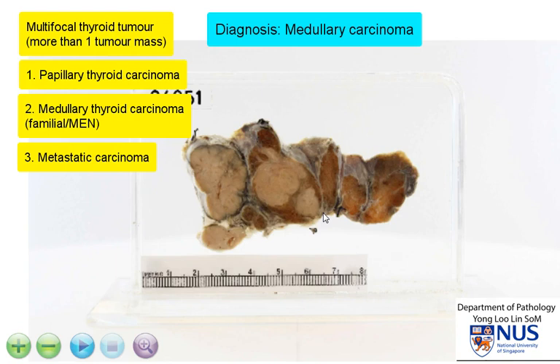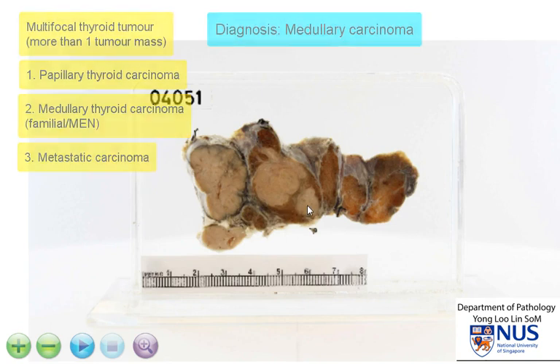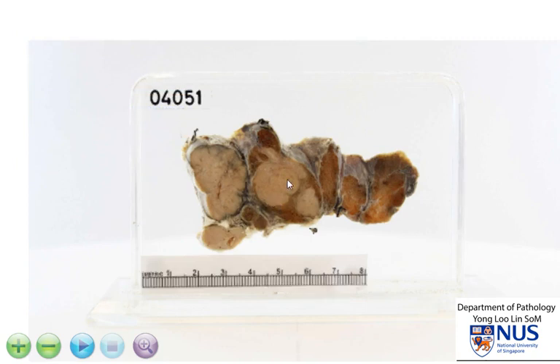So it is not really possible to tell them apart looking at the gross appearance. However, on microscopy, they look very distinct. To summarize, this is a multifocal tumor in the thyroid gland, and the main two differential diagnoses include papillary thyroid carcinoma and familial medullary thyroid carcinoma, or medullary carcinoma in the context of MEN.